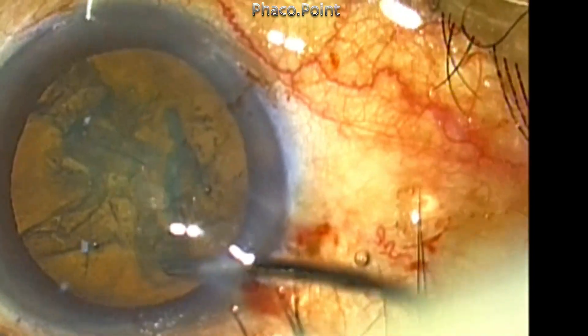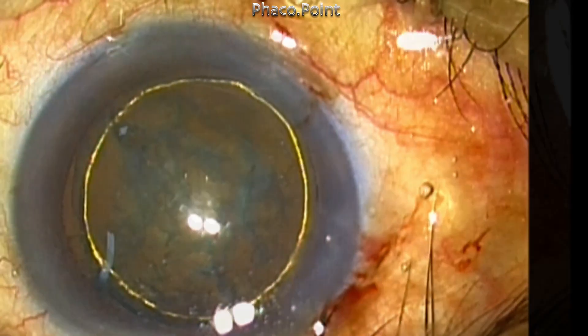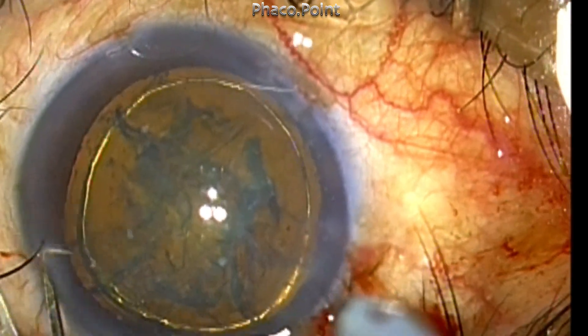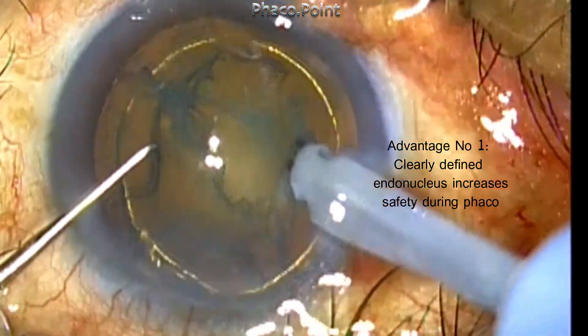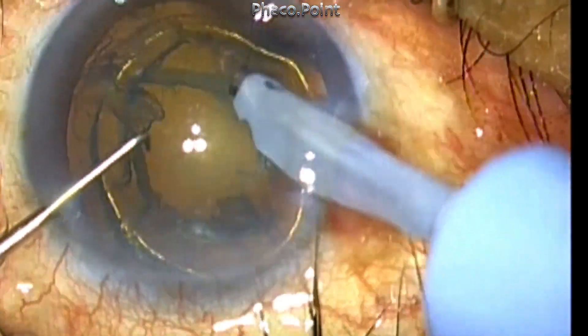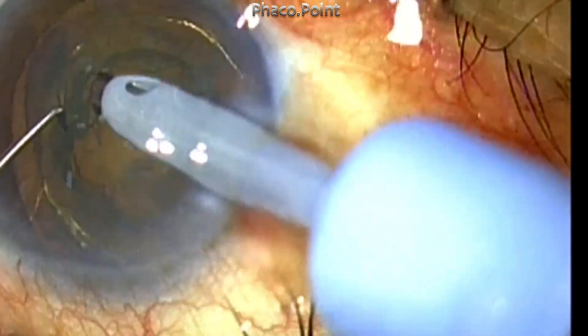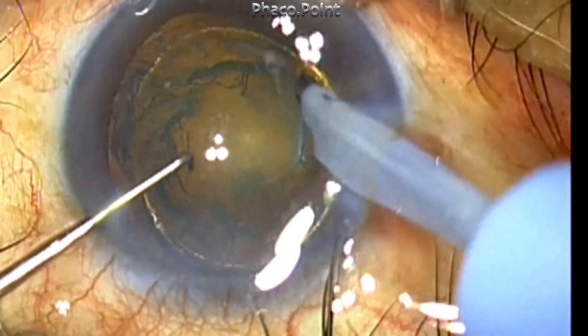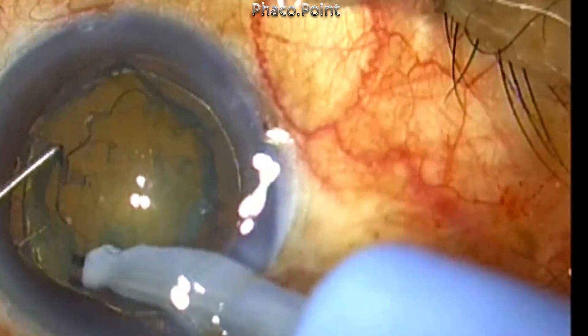This creates the cortical cleavage hydro dissection, following which the hydro delineation procedure is completed. The first advantage is that the hydro delineation will clearly outline the endonucleus, which means that you do not have to carry the phaco probe beyond the extent of the clearly demarcated and defined endonucleus.